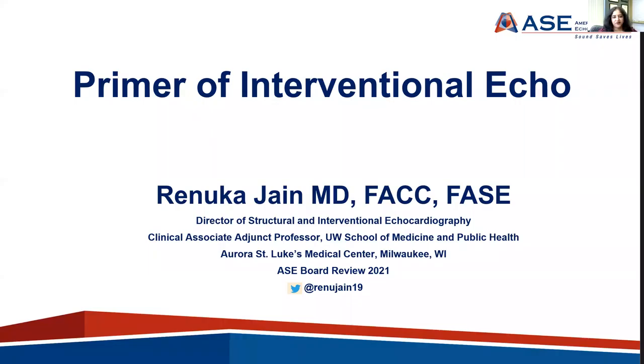Hello, this is your primer of interventional echo. In this talk, we will familiarize ourselves with the field of interventional echocardiography, review key structural cases from an echo perspective, and highlight material that you may see on your echo boards.